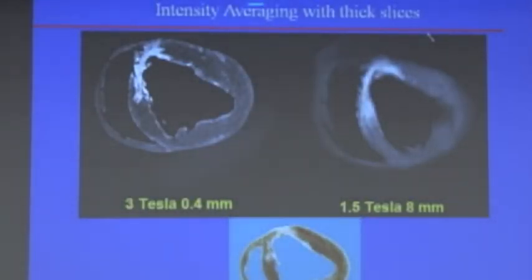So then partial volume effects. This is really where the gray zone area really becomes grayer. Because in fact, what can happen is that here's the anatomical pathology showing the scar with very fine fingers of scar mixed in with the normal-looking tissue here. And with this 3 Tesla, very thin slices, you actually see this with exquisite detail.